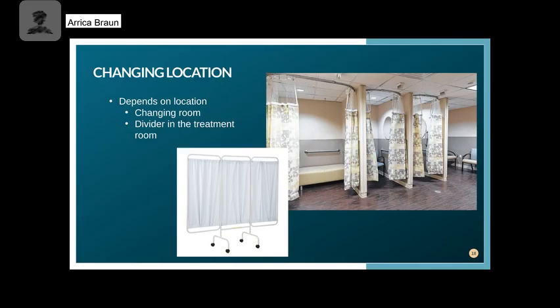As I mentioned before, your changing location is going to look different for every facility. Some places have the space to create true changing rooms for the patients, or they may have a larger area with cut off curtains or dividers. Where I did my clinical, we just had a corner within the treatment linear accelerator room, and we had curtain dividers over there, so we could just send the patient on in. They knew where to go. And then we could see on the camera once they got to the table.